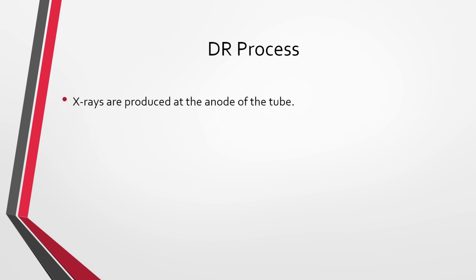The DR process, let's go ahead and break down the DR process. We've talked about the technologies: TFTs, CMOS, CCD, which is the collection element, what coupling elements are, what the capture elements are, and direct and indirect technologies, flat panels. So that's all the basis of DR right there.